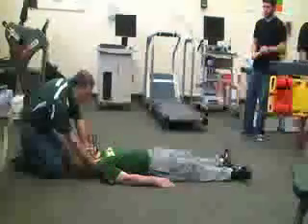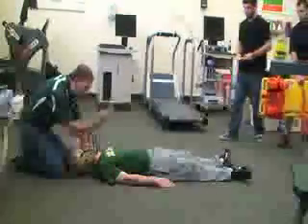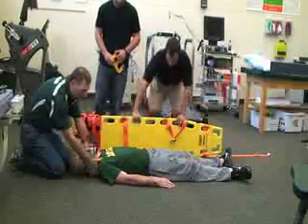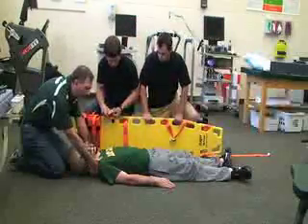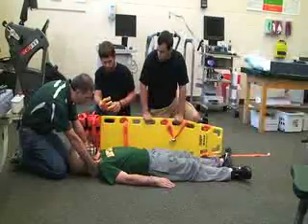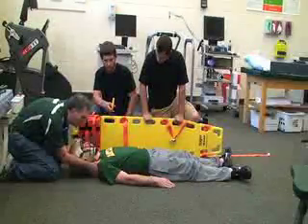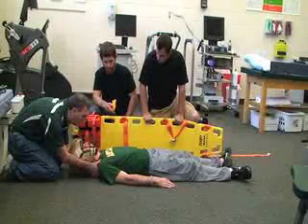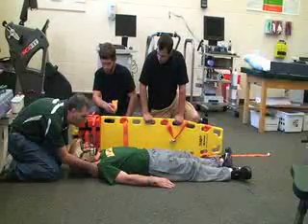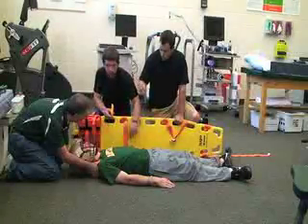I'm going to have my position at the head, cupping — the webbing of my thumbs are going to be around the shoulders on this one. I can be as close as possible, kneeling down so that he's not moving. Come on out, bring the backboard. If we needed to remove the face mask, go ahead and grab a couple of the face masks — they're right over my shoulder.